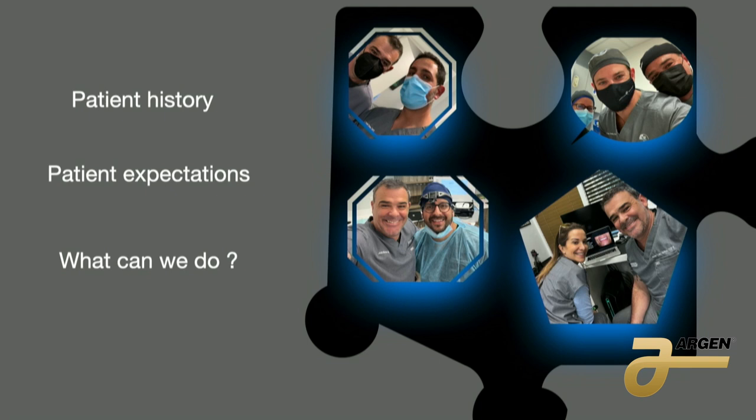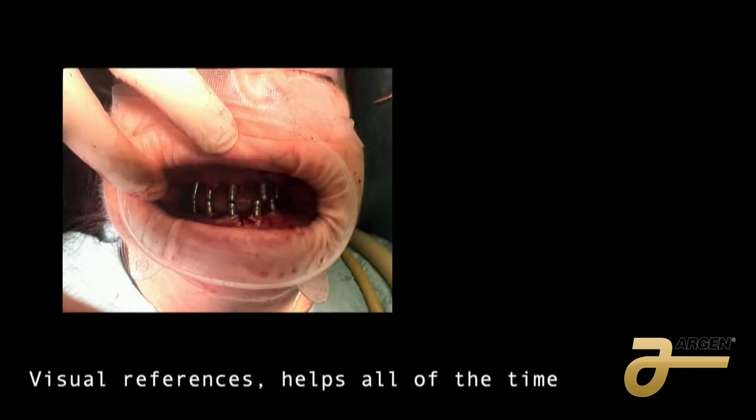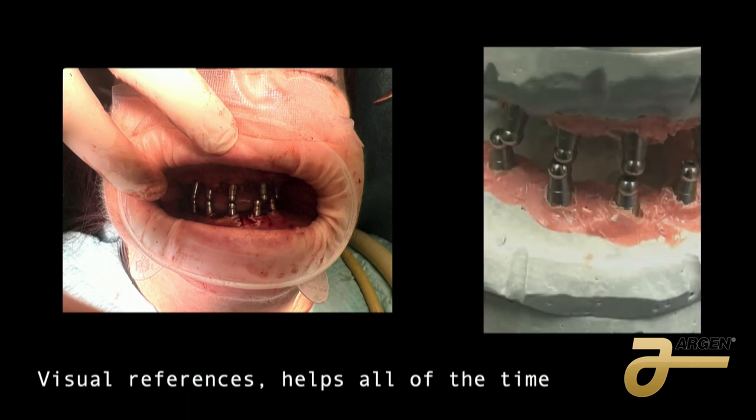The other thing I do in the protocol is a lot of visualization of the process. For example, if we're going to take an impression, we have visual references — in this case, we put the patient bite. I take an impression and then in the lab I can see more or less if I am close. It's not perfectly accurate, but with the visual reference I know I am close.